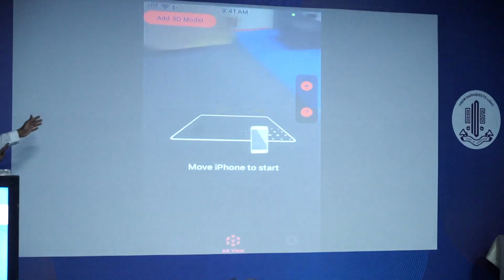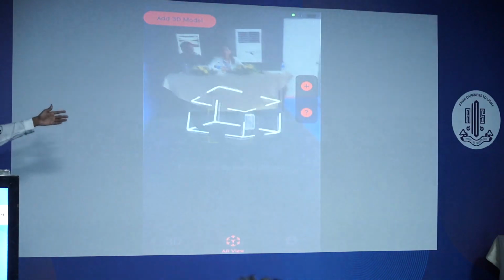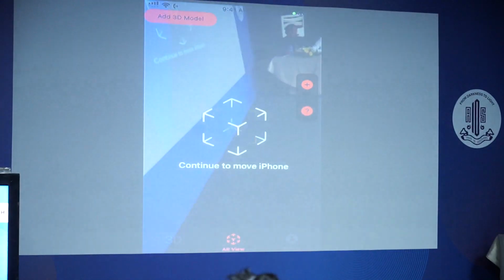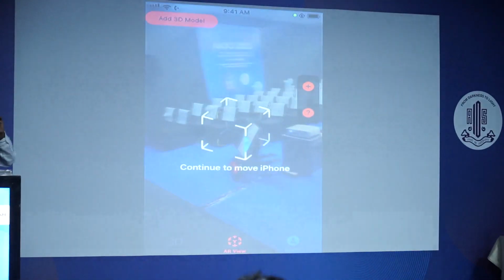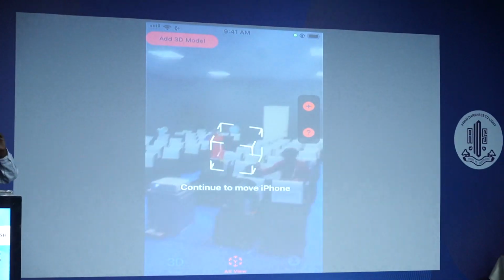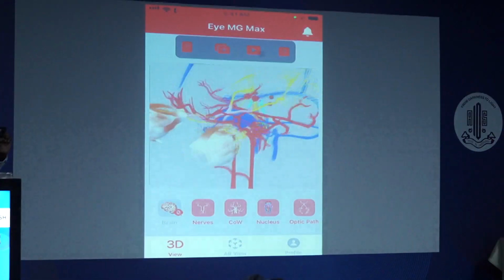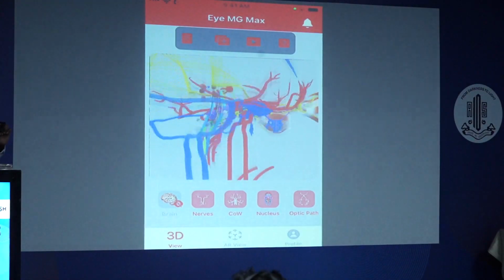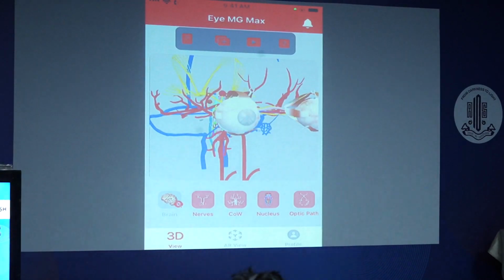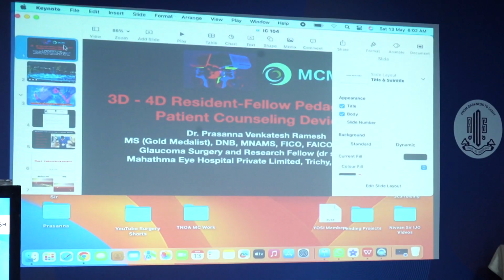So the same thing in AR mode with good lighting, you scan the environment. You can see that my fellow colleagues Dr. John and Dr. Hirika are also there in the background. The same concept with good lighting, you can also have in augmented reality. I'm finding it difficult to do, but this, my dear friends, will not give any blind spot to the user or the pedagogue, where he can go into the eye and have a good evaluation or good idea of what the sub concept is.